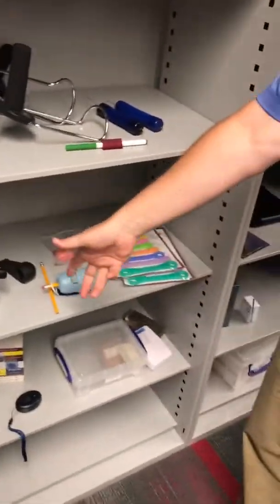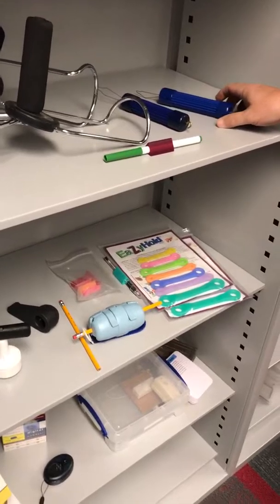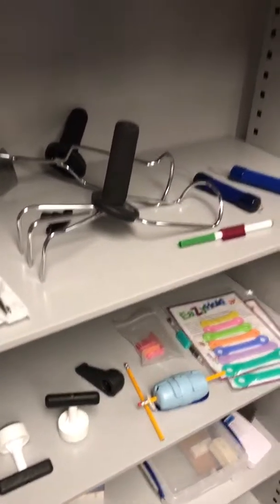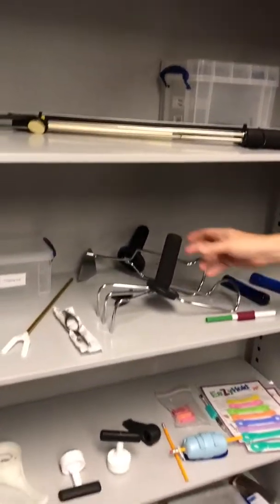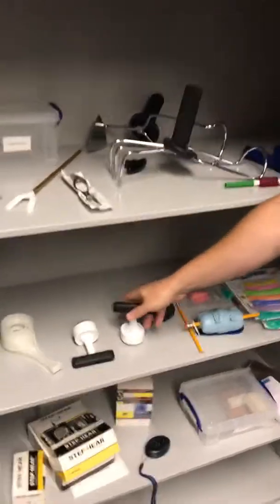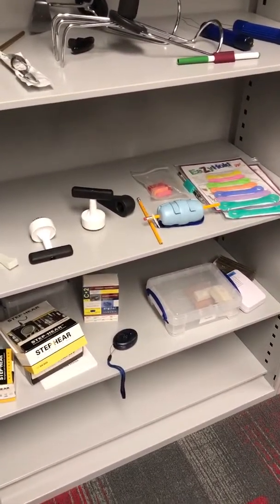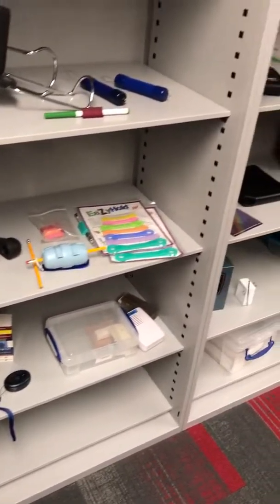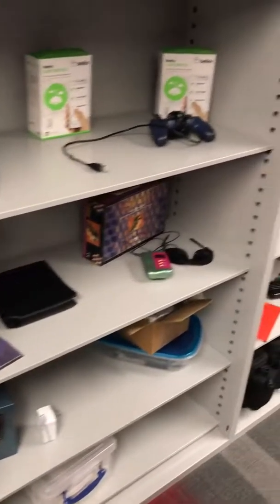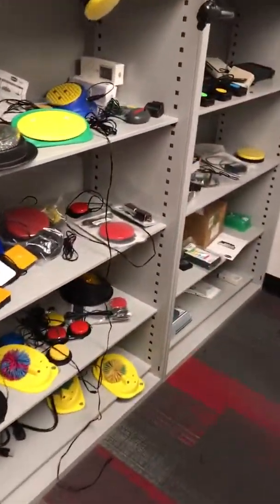Therapy stuff to help you grip. Now in public schools you'll see a lot of kids that have these special grips. These are reachers. This is stuff to help you in the garden, to use your shoulder strength instead of your arm strength. These are turners. Just various stuff that we don't deal with a lot in occupational therapy, but we do have a little bit in place there. And then here's our collection of switches.